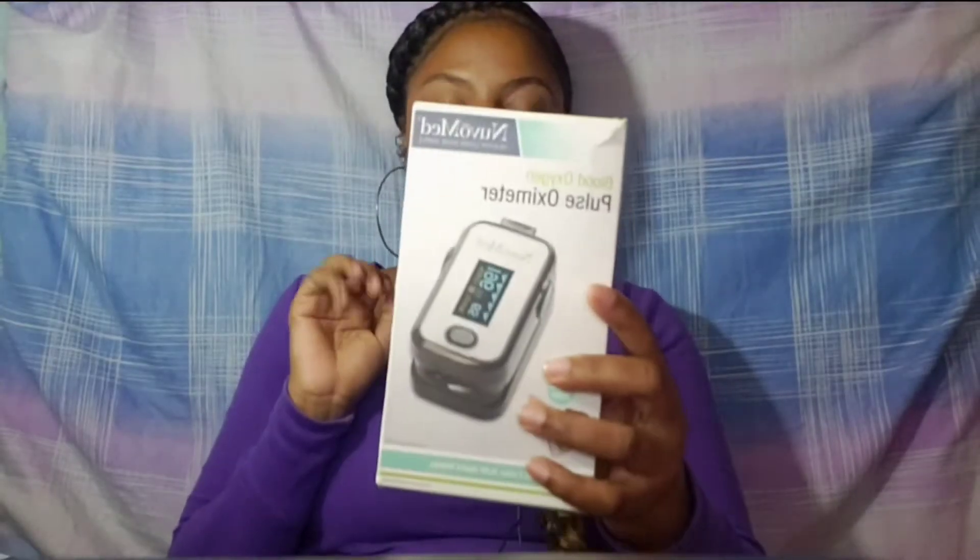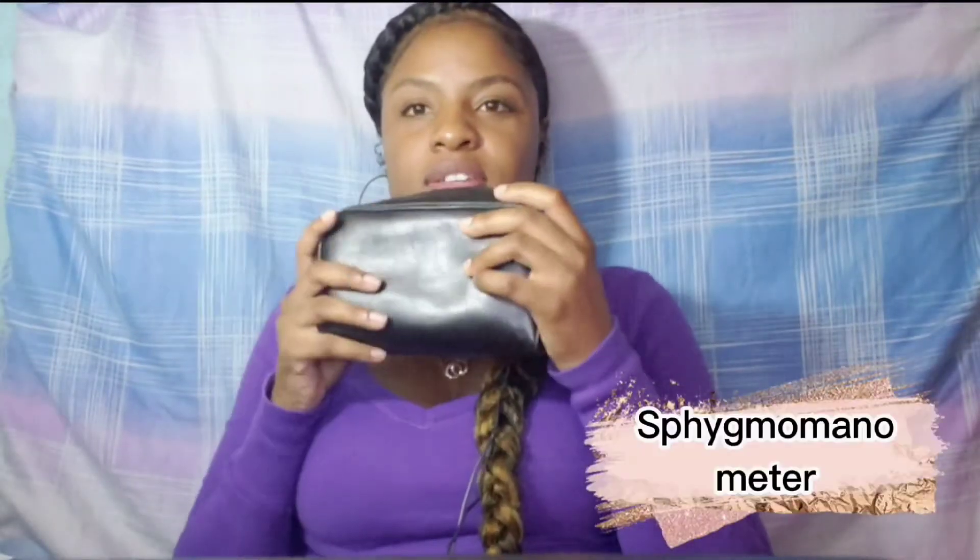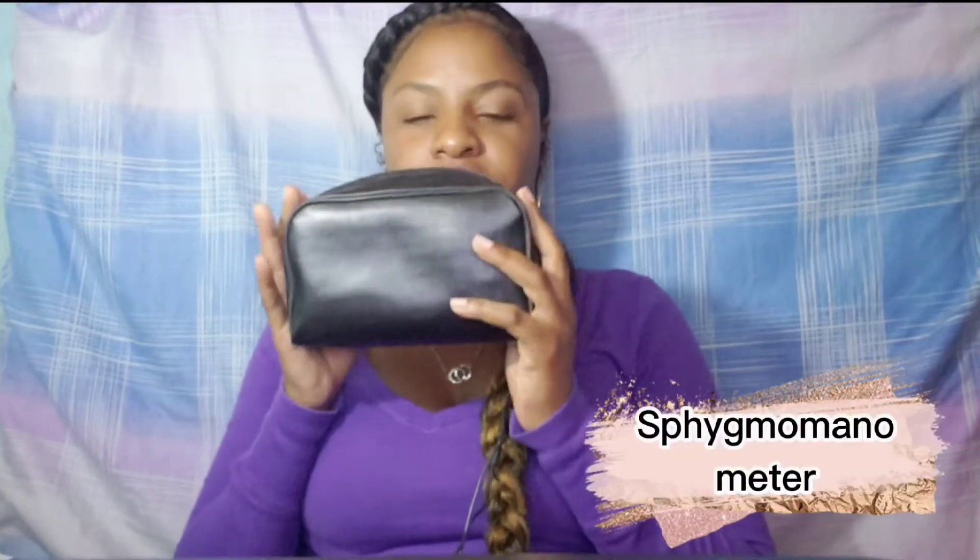Then I have this pulse oximeter — this is to test your SpO2 or blood oxygen levels. It also tests the pulse and so on. The hospital usually has them, but I prefer to get my own. You put it on your finger and it takes the pulse and the SpO2 levels.